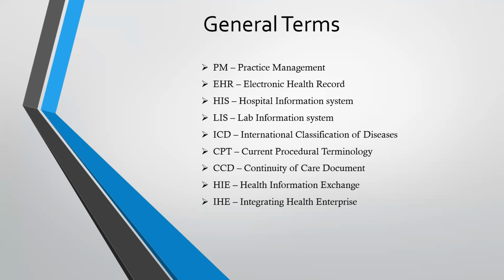Next, you have LIS or LIMS, which is nothing but lab information system or lab information management system. This is another application used specifically by laboratories to handle their orders, results, and all. So we have various labs, right? Quest, LabCorp, and many other different labs. Those labs will be using this specific application.